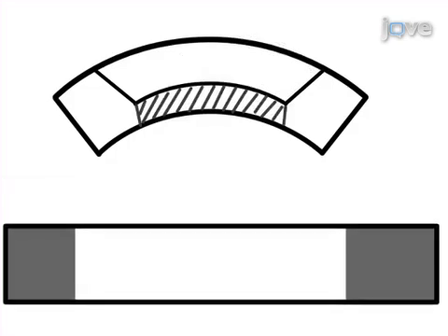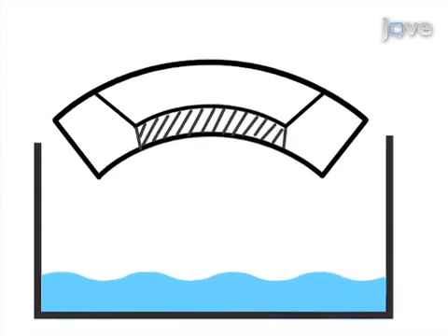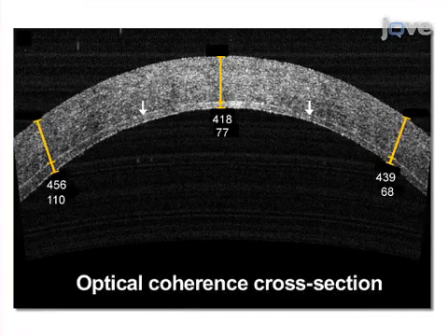The final step is to carefully transfer the cornea from the artificial anterior chamber to storage medium. Ultimately, successful lamellar graft preparation is verified via slit-lamp viewing of the cornea and specular microscopy of the endothelial cells.